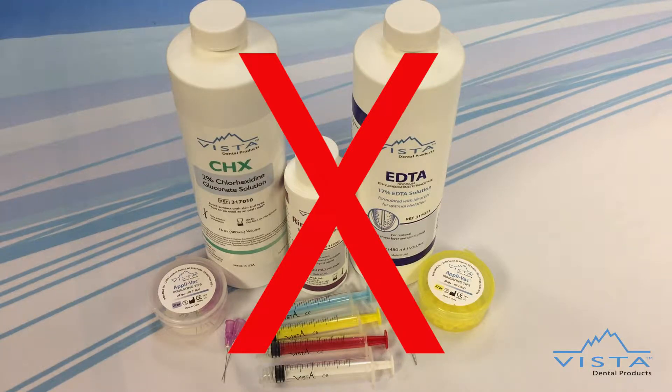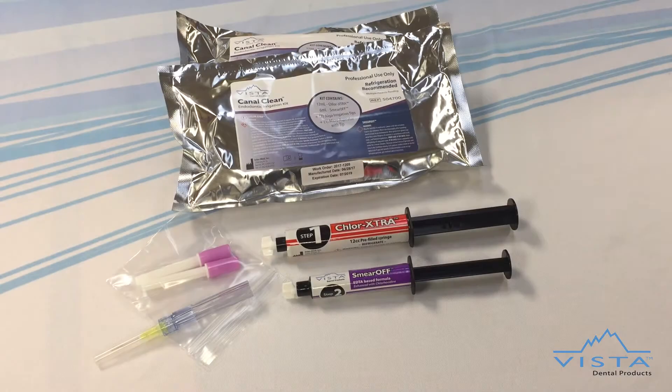Enhanced sodium hypochlorite and a combination EDTA-CHX product will save you time by reducing the number of irrigating steps needed and eliminating the need for a rinsing agent. Both Chlorextra and Smiroff are 100% compatible and will not form a precipitate when mixed.